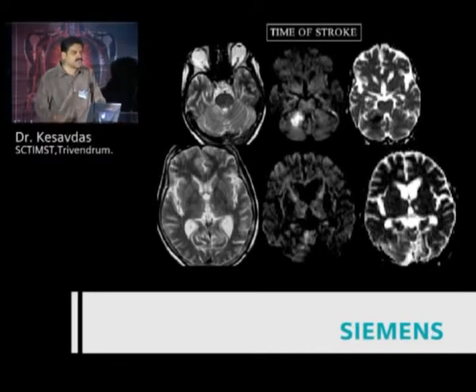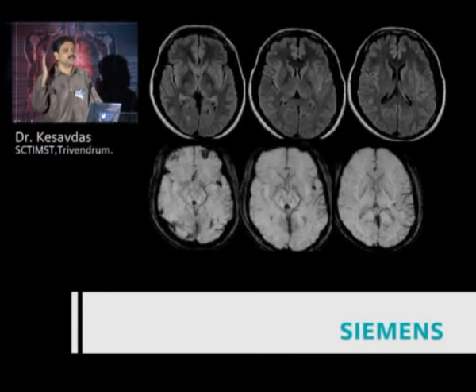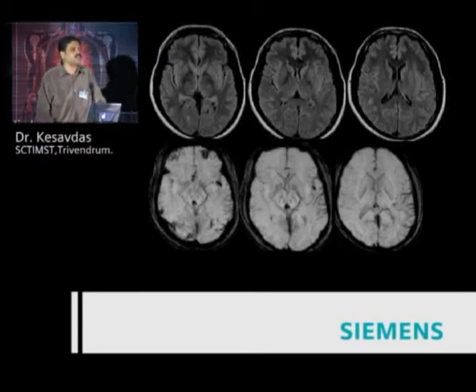We had a few cases where we actually totally missed stroke in the diffusion. Harsha was asking me about the stroke protocol, and in all stroke protocols we have a FLAIR sequence, diffusion weighted imaging, perfusion imaging, and a TOF MRA. So this takes about 15 minutes on a 1.5 Tesla machine. And susceptibility weighted imaging. So these are always there.